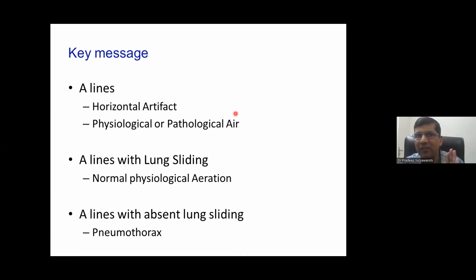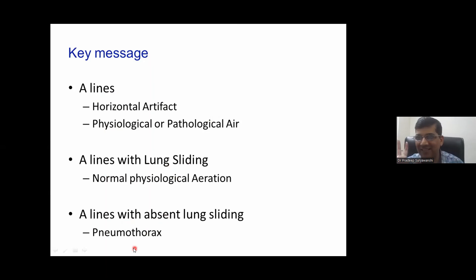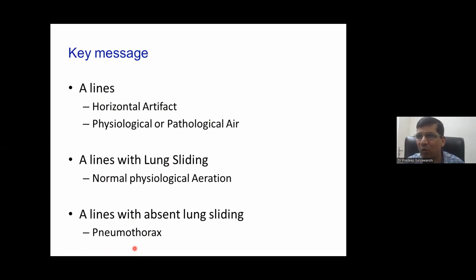To revise: A-lines are the horizontal artifact — they can be physiological or pathological. A-lines with lung sliding means normal physiological aeration. A-lines with absent lung sliding indicates pneumothorax. It's very simple. If you understand these four points, you will enjoy diagnosing pneumothorax by lung ultrasound.